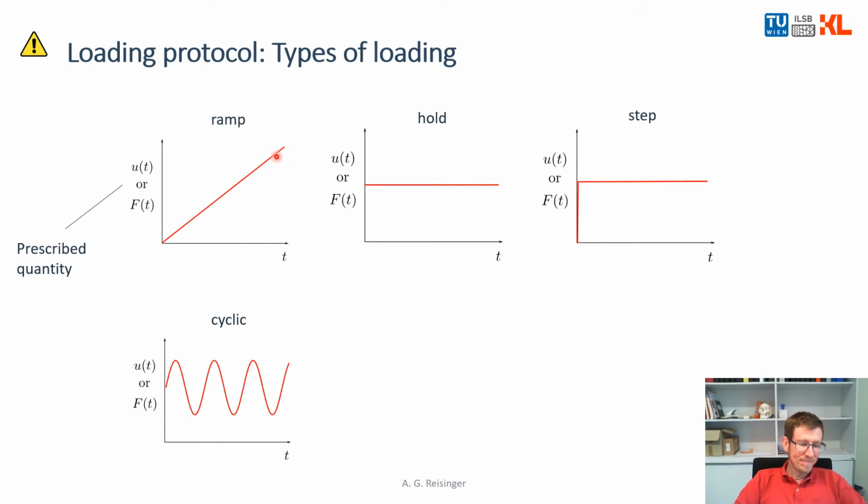Then, imagine you would like to measure something different. Yeah, so when you think back, when you remember, for example, this experiment where we would like to measure the fracture load of this bone implant construct, here we applied a ramp load. So we push down, down, down, down, down until we reached our failure load.